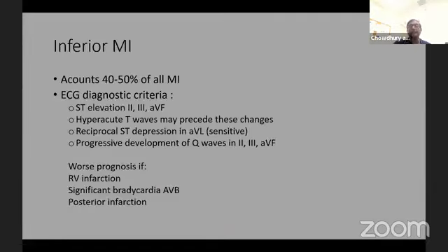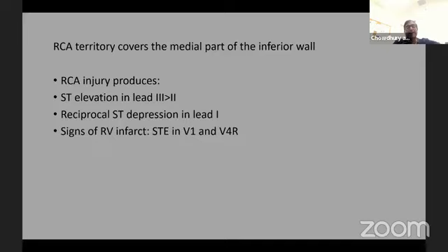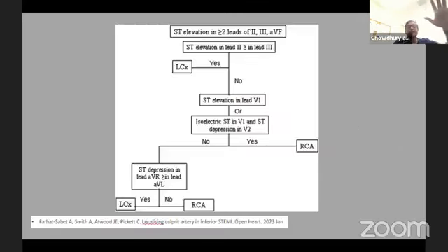So it is important to go to the cath lab knowing everything. Localization in the inferior leads sometimes can be problematic. So you need to look at the ECG criteria, RCA versus circumflex. Sometimes a diagonal STEMI can be present in lead 1, aVL or OM, but it is important to localize because that has significant clinical implications. They go with this criteria. Sensitivity and specificity can be a problem, but it is important to follow.